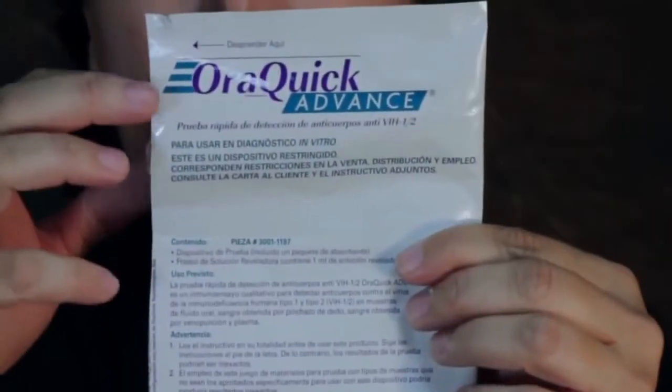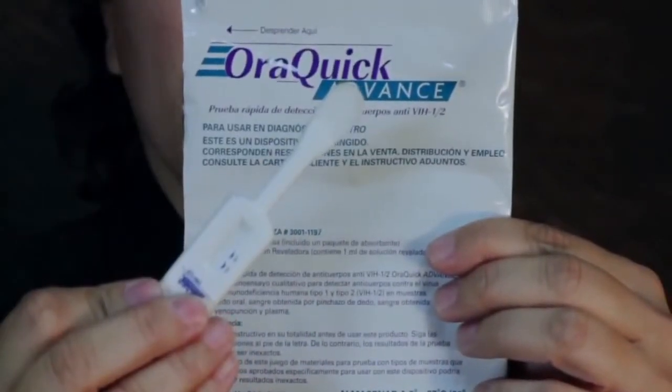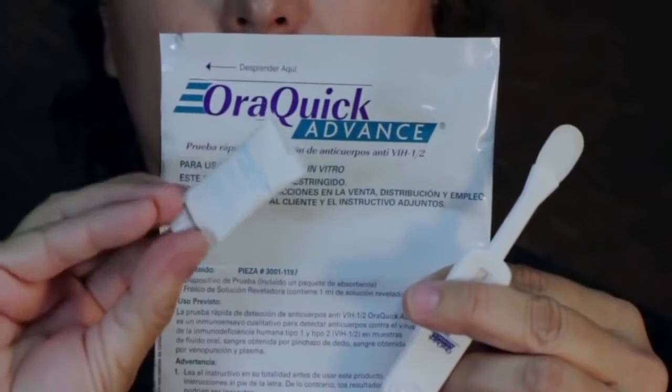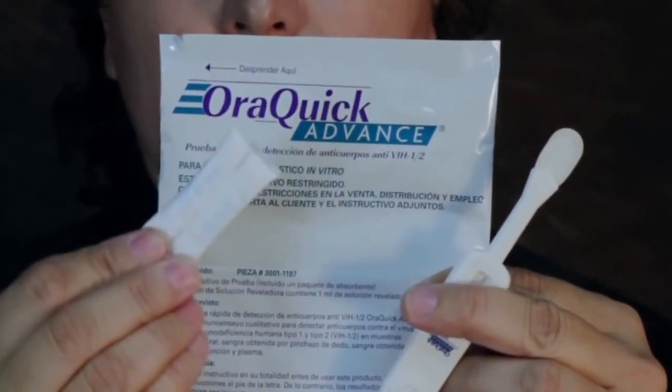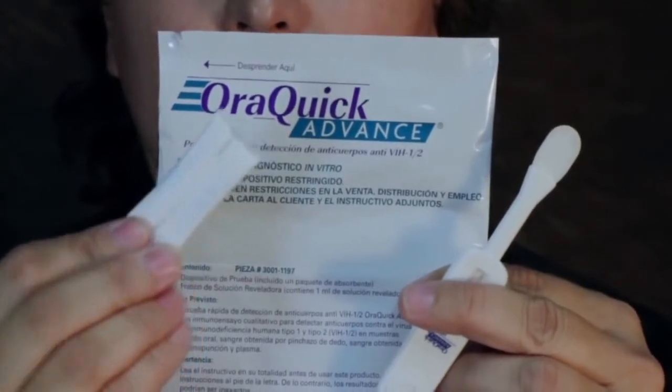Stage 1: Collecting the test sample. Have the person being tested open the package and remove the test device from its pouch. Do not allow the person to touch the flat pad. Make sure a moisture-absorbent packet was included inside the test package. If no packet is present, discard the device and obtain a new test pouch. The packet is not used in the testing process and should be discarded.